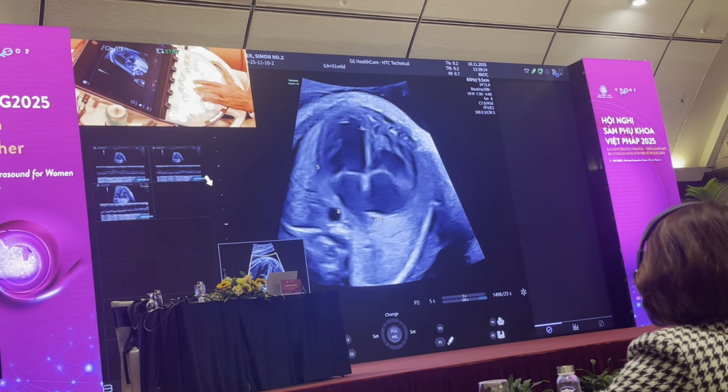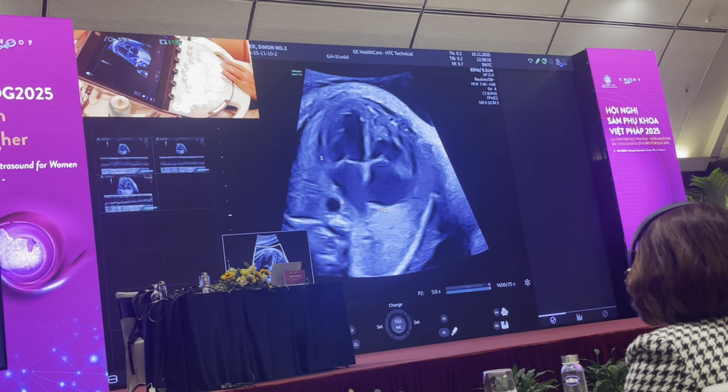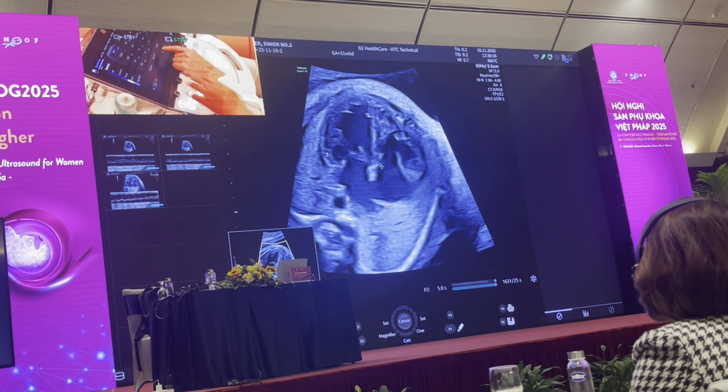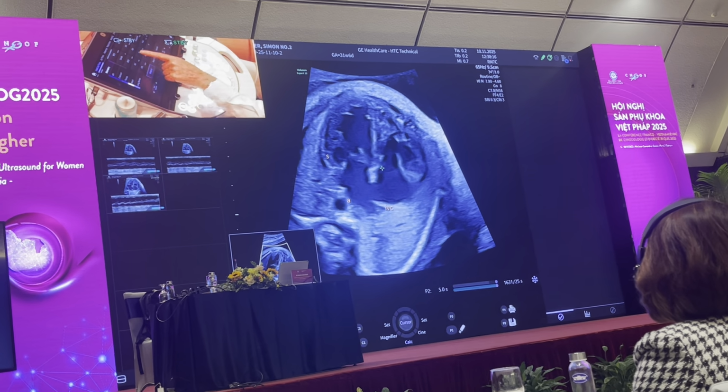The next section is looking at section 2. So when I mentioned to you the ratio, to calculate cardiac thoracic ratio, can you do that? Cardiac thoracic ratio?